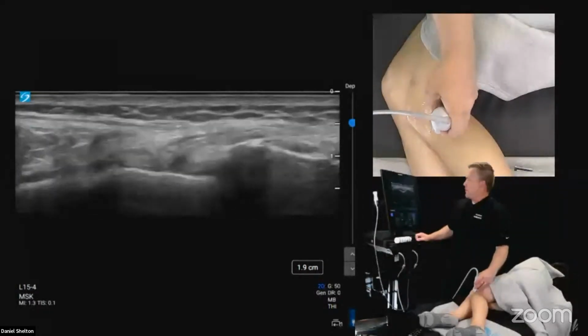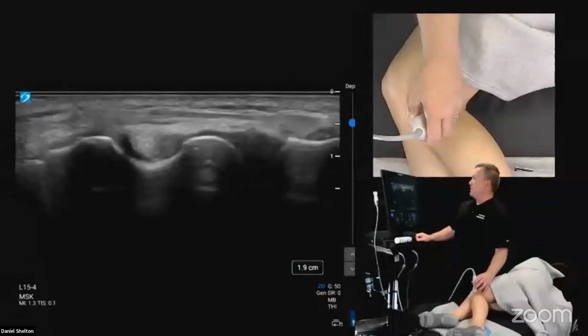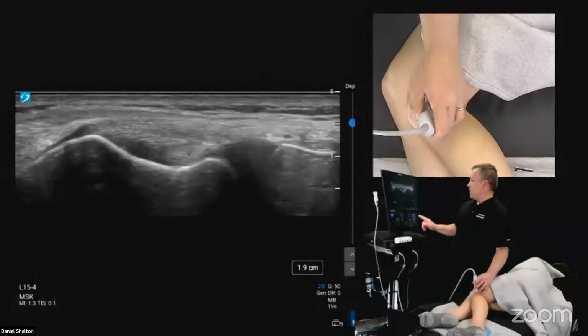So earlier we had the popliteus groove. We'll just play around with the ST for just a second. So I'm going to throw an arrow up here.